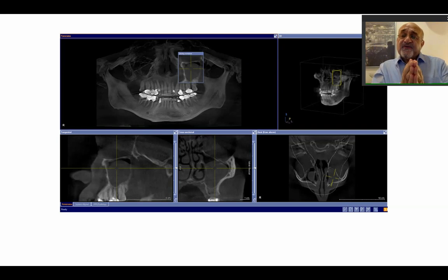So machines, again, as we said, are categorized according to the area of coverage that you want to see. In other words, how much of a patient structure you want to see, from the smallest to the largest possible, and the needs can be tailored according to your practice.